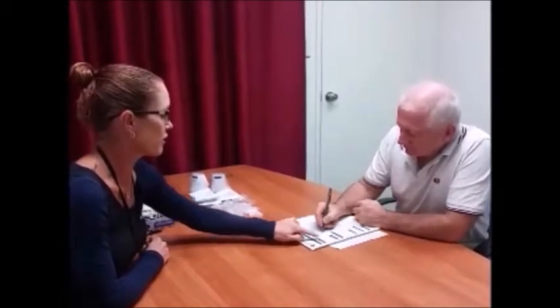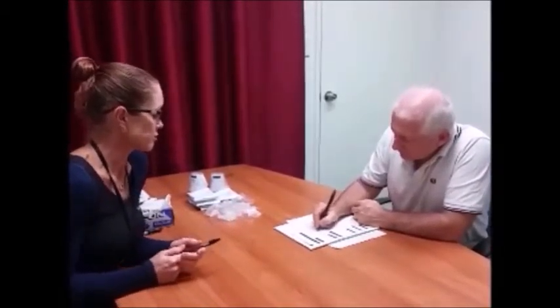And Michael, do you consent to going ahead with the test? Yes. Okay. Can you please sign on the yellow shading and date it, ensuring that the information I've written on there is correct?